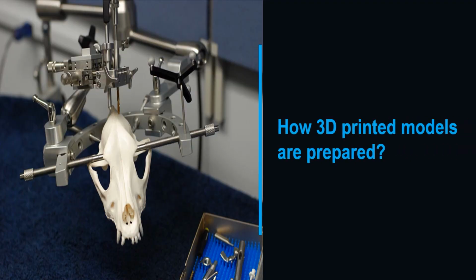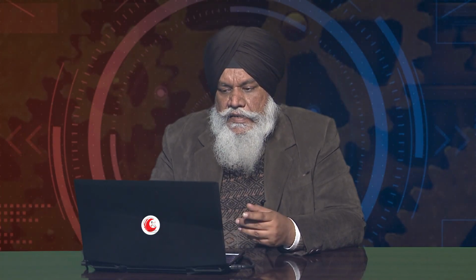Okay, so 3D printed model fabrication for veterinary patients is quite common. Nowadays, a lot of veterinary hospitals are short of cadavers for training their young doctors, right? So one area where 3D printing can be helpful for doctors, specifically in veterinary, is in making models on which preoperative surgical planning can be done. Then another area is the development of prosthetics and implants. So again, in this case, for the development of models, the procedure is the same.